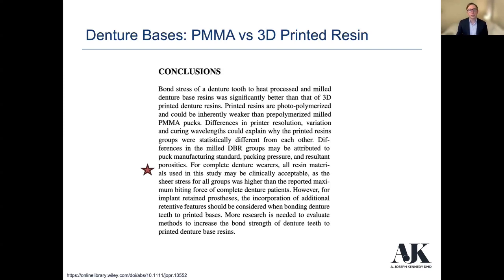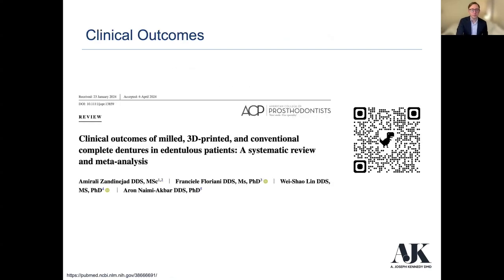All resin materials used in the study may be clinically acceptable, as the shear stress for all groups was higher than the reported maximum biting force of complete denture patients. So the takeaway here is, yeah, we know that maybe the printed resins aren't as strong or able to withstand the shear forces as some of our more traditional methods, heat process in particular. But for complete denture wearers, where they don't have a ton of great strength and they're probably not putting a ton of shear forces on these dentures, it's acceptable for this type of use from a clinical standpoint.